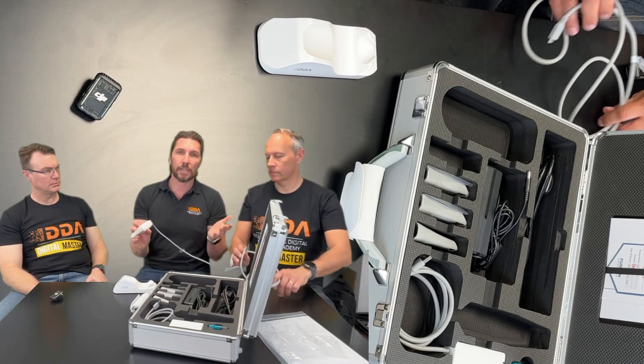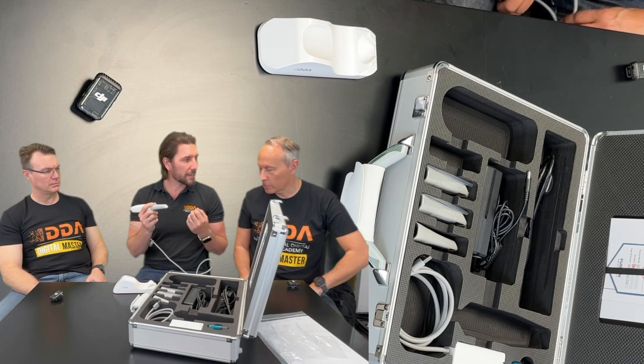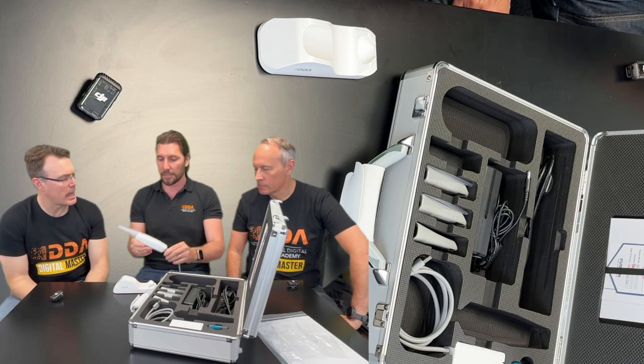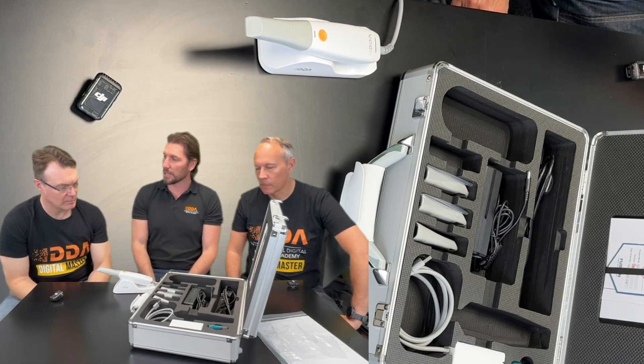Some international scanners can sometimes feel a bit cheap — this doesn't. It's a really nice, light, good-sized scanner. Simple, small, and ready to get you going in your daily practice.